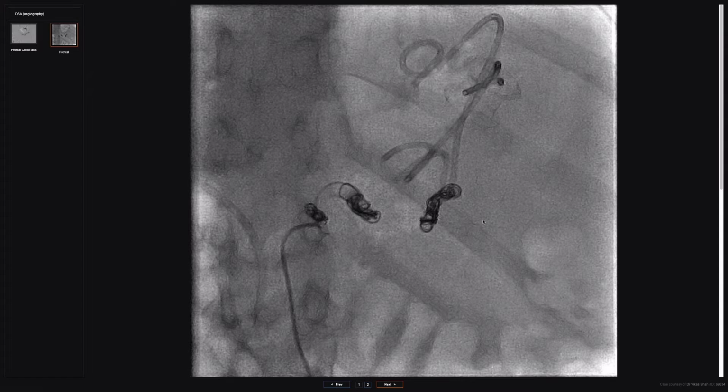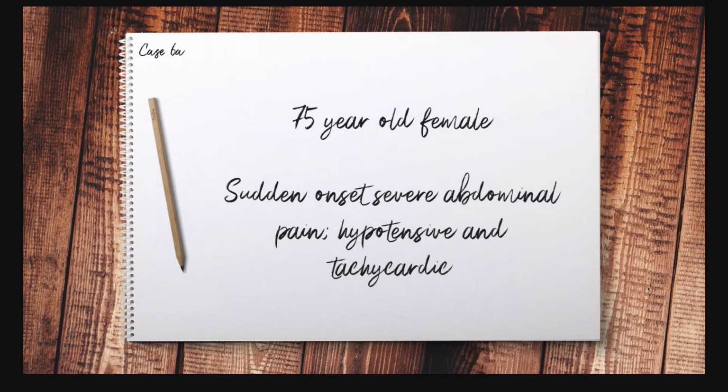The reason is your arterial phase study is for giving you an arterial map and checking there are no pseudoaneurysms, and the interventional team find it really useful. And then your portal venous phase is for checking for any bleeding from a pseudoaneurysm, checking for pancreatic parenchymal enhancement, defining your pseudocysts, looking at venous enhancement to check that there's no splenic or superior mesenteric or portal vein thrombosis, and also to evaluate the other abdominal structures. So it's really important in that setting to use a dual phase contrast regimen.